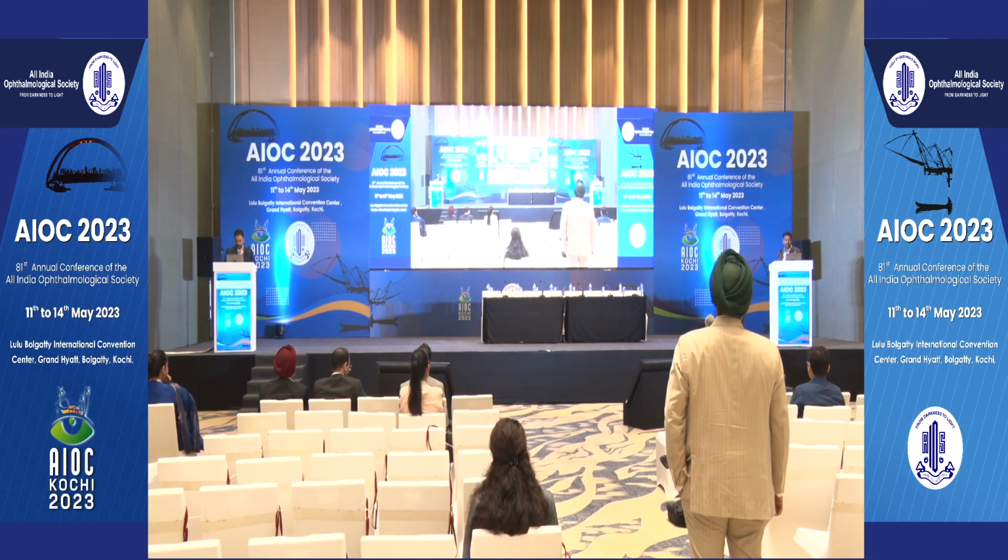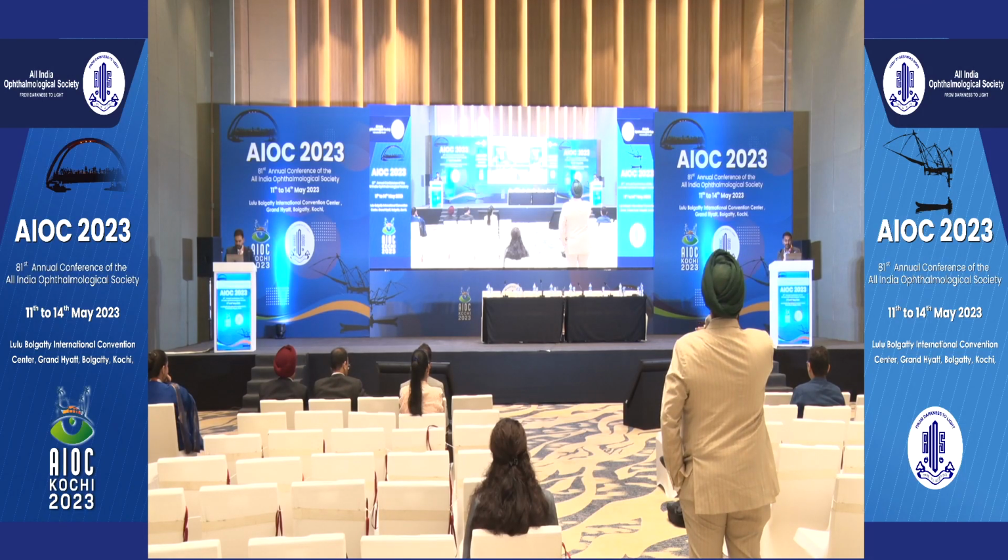If you do a laser hyaloidotomy, do you think that was a factor in causing the hole? Or was it just the contraction that caused the hole?